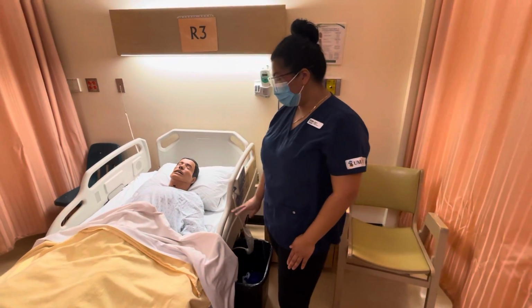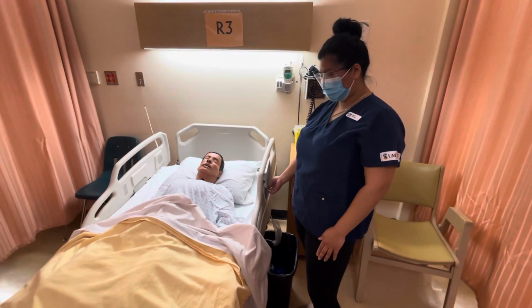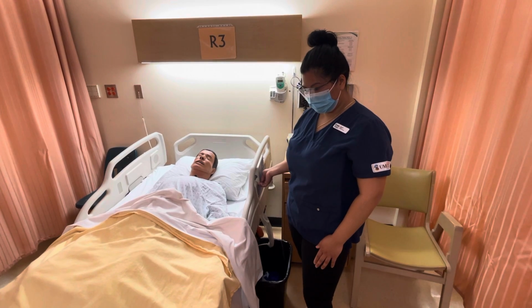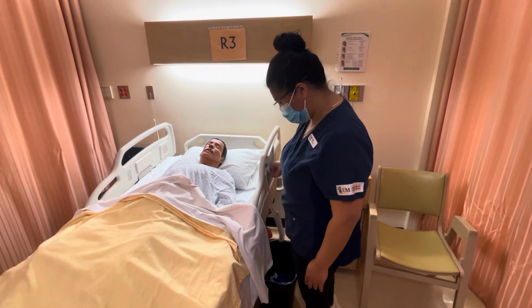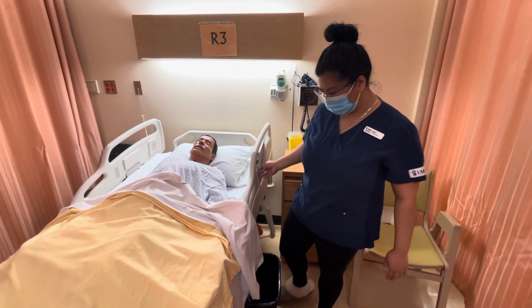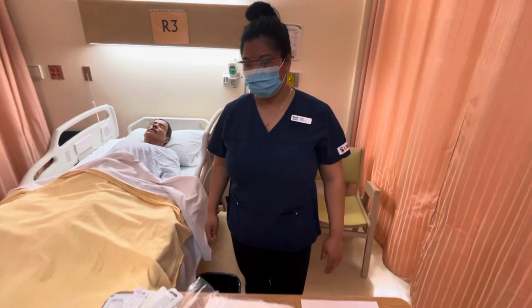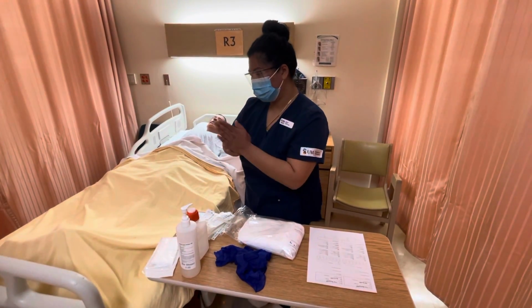So before I get started, I'm going to raise the bed to a good working height, okay? So we'll raise the bed to a good working height. Okay, that's good. So Ms. Maragamo, I'm just going to get my supplies ready here, okay? So, we want to do hand hygiene.